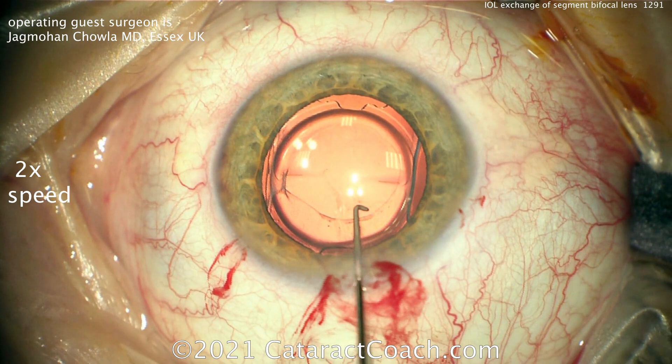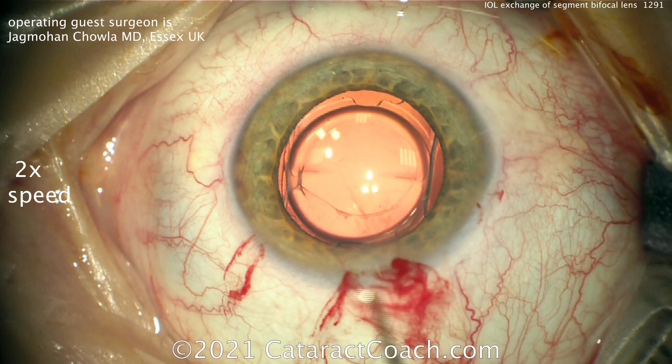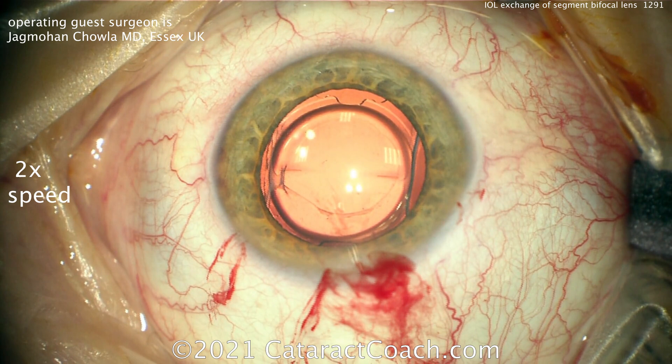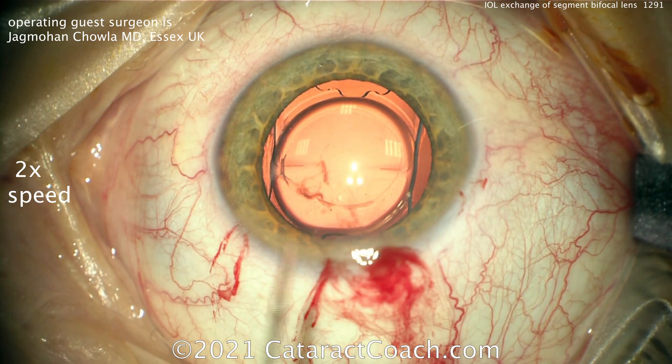You can see the original rhexis has contracted down a little bit and wasn't perfectly round — that doesn't matter, but you don't want to damage the capsule at all. This patient has been at least a few months post-op, so you can get contraction of the capsule and adhesion of the anterior capsular leaflet to the posterior capsular leaflet, making it harder to remove. He's just taking his time to really get some dissection going. Once that's done, here comes the viscoelastic — this is the secret: visco dissection.